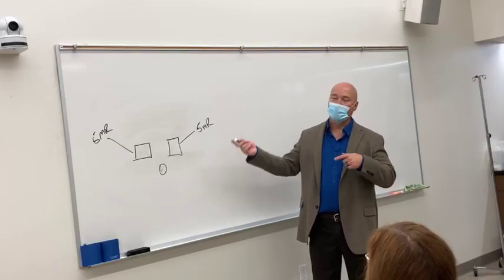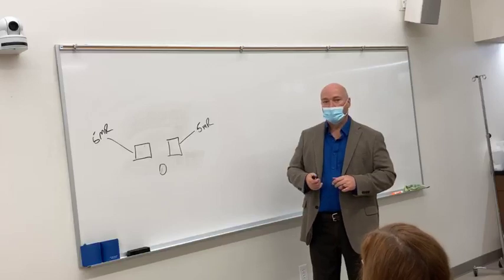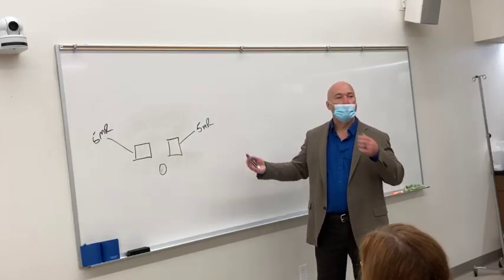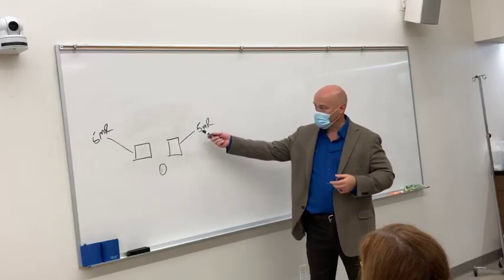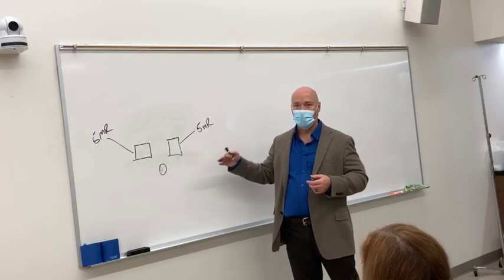Now we go from that patient to a pediatric patient, a little bitty patient. If they're that little, we're going to make some other changes. But let's say a 12-year-old. What are these going to want? 5. The same thing. So it's just going to terminate sooner.